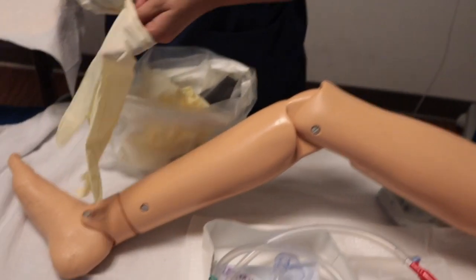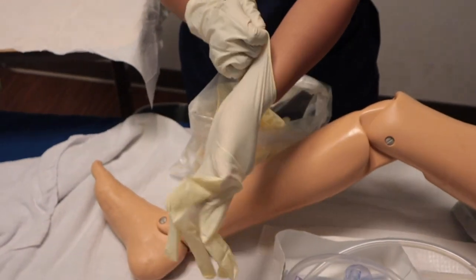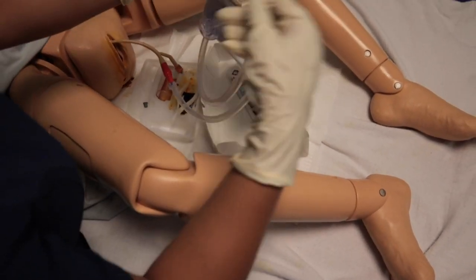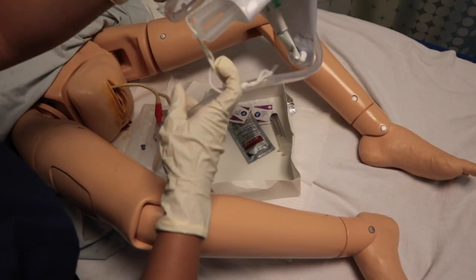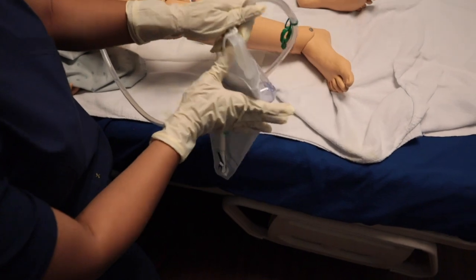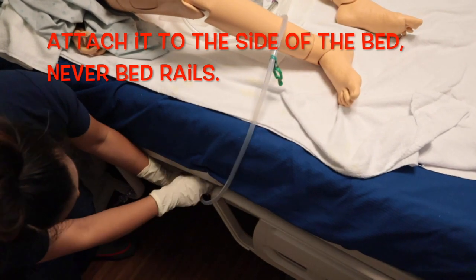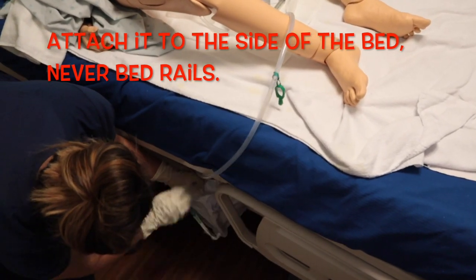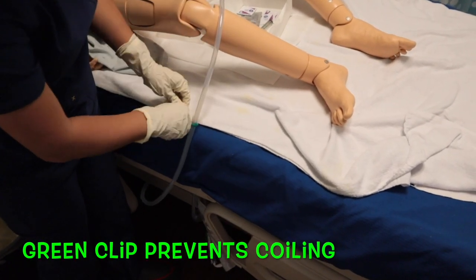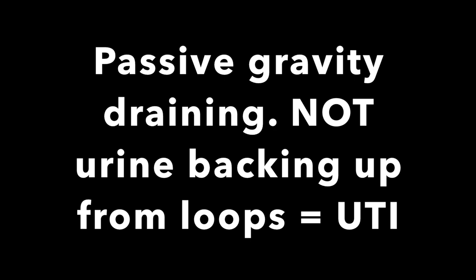I have taken off the dirty sterile gloves and am now putting on normal clean gloves. Grab the drainage bag from the kit, uncoil the tubing, making sure there are no loops. Attach it to the side of the bed. Never attach it onto the bed rails because those get moved up and down and can pull on the catheter. The green clip just clings onto the sheet of the bed to make sure the tubing stays uncoiled. You want passive gravity draining, not urine backing up, because that can cause a UTI.